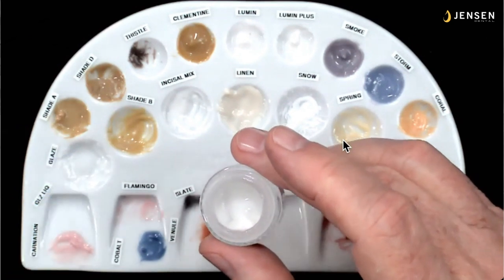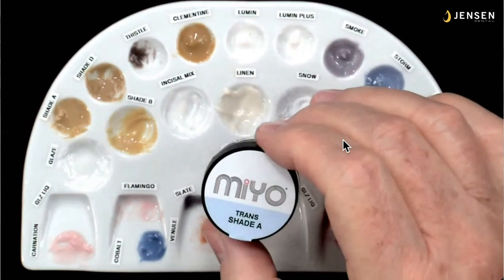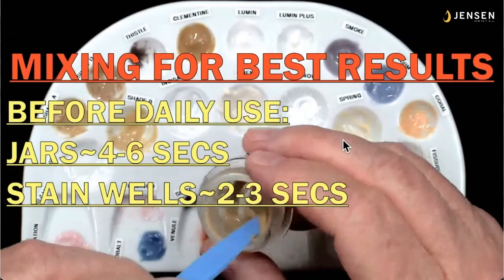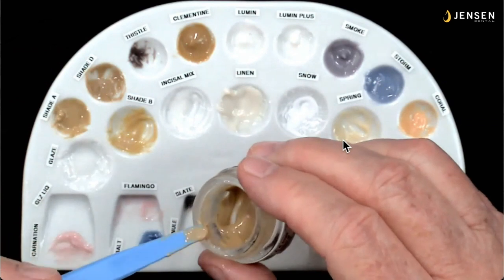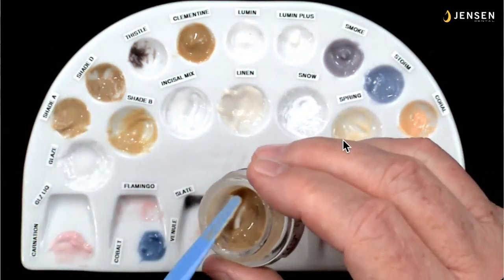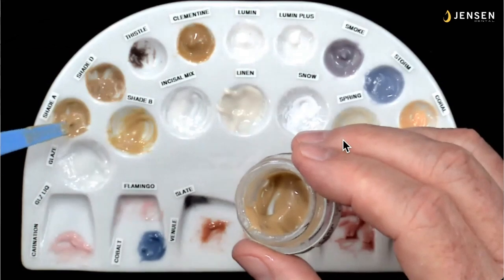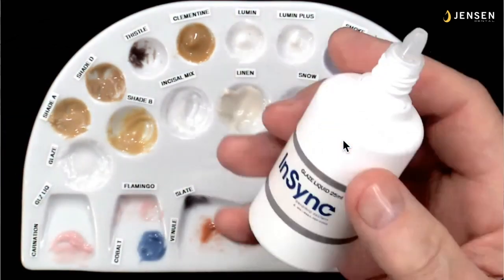I would suggest you don't work right out of the jar all the time because it dries out and it gets dirt in it and things like that. And here we have our shade A. Again, for best results, if you take it out of a jar, about a 4 to 6 second mix, and about 2 or 3 seconds if you're putting it in a well. So I'll put a little bit here in the shade A well. Wipe off my spatula. Again, a non-metal spatula, because as much as you're going to be mixing this every day, even just a little bit, you'll get metal particles in there.